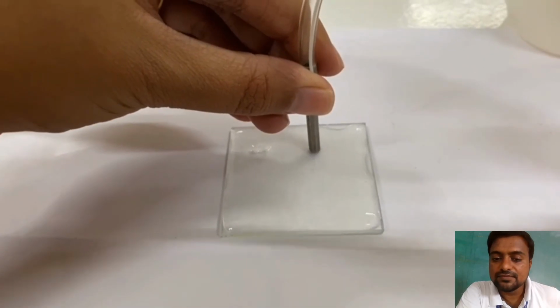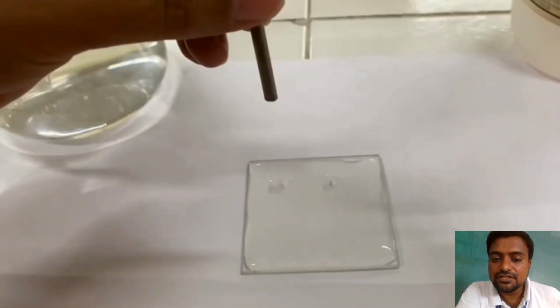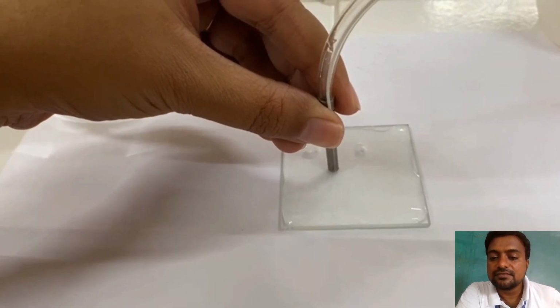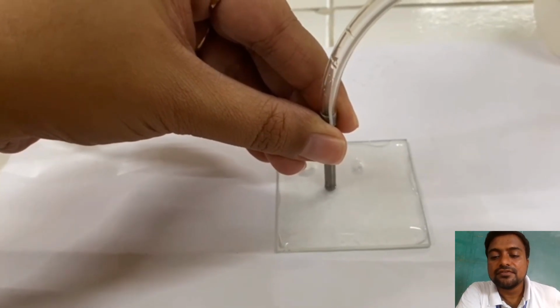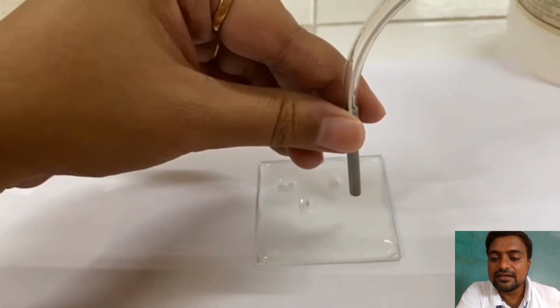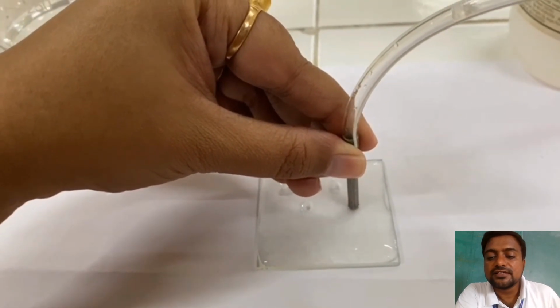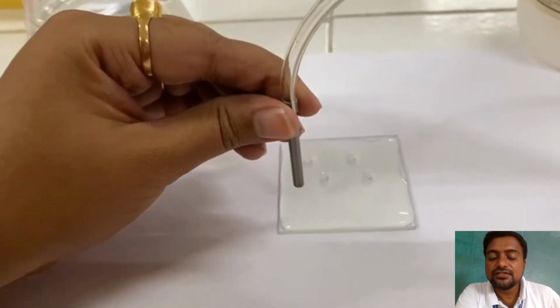Once the gel is polymerized and solidified, we use a gel puncture apparatus and make wells by sucking up the gel from that disc. This leads to the formation of circular disc-type wells, as you can see.